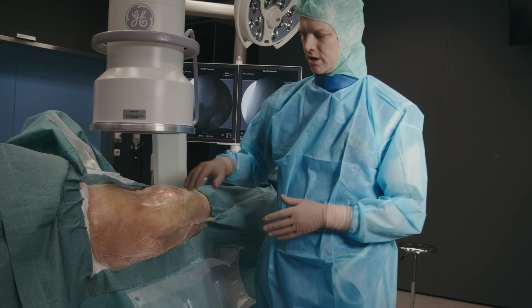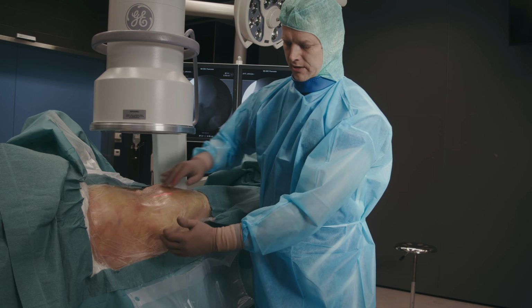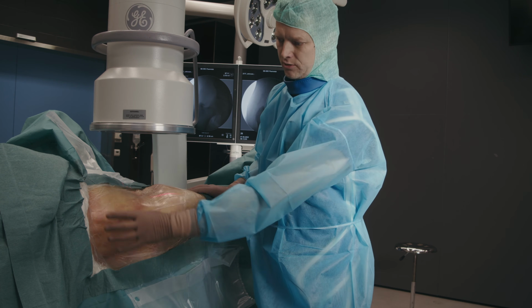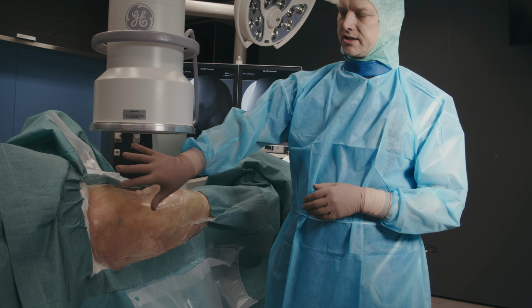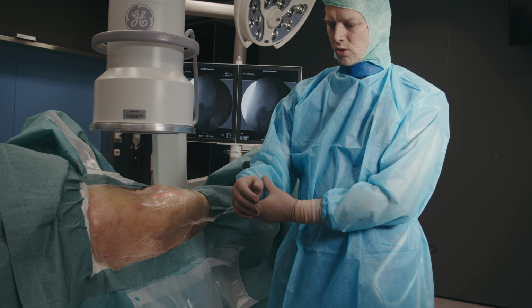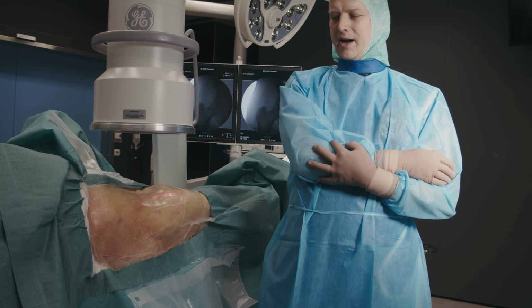When draping, it is important to extend the draping high enough. The nail will be inserted obliquely from above at the level of the greater trochanter, so the drapes need to be placed cranially enough. Also, the patient's upper body needs to be bent to the contralateral side of the fracture, and the ipsilateral arm should be placed on the trunk, for example in a sling, so that it will not obstruct the procedure.